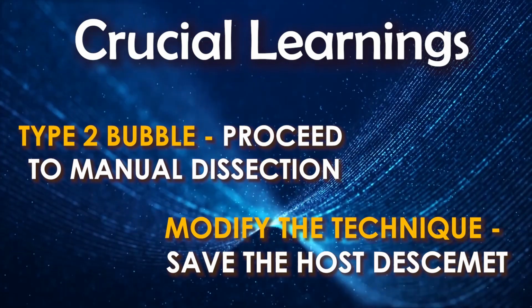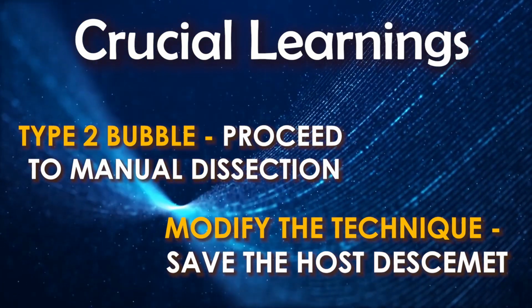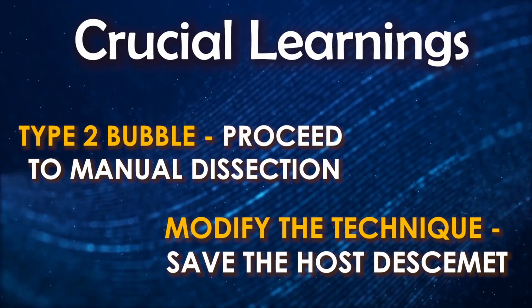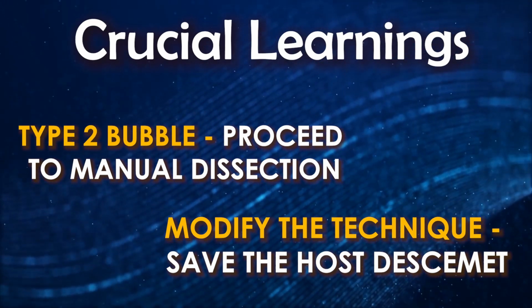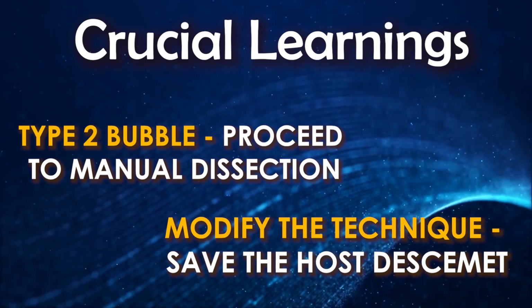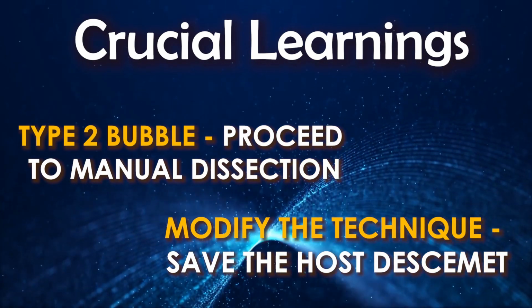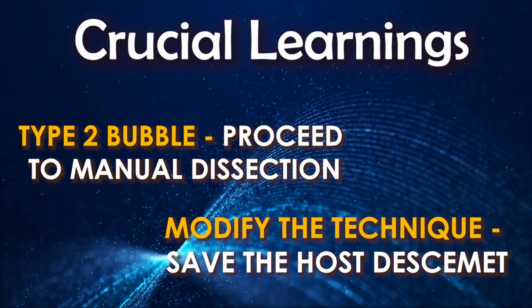Thus, it is important to modify the technique of DALK based on the type of bubble we achieve. One must always try to save the host Descemet for early visual rehabilitation and the immune privilege the patient achieves with DALK, rather than converting it into penetrating keratoplasty.